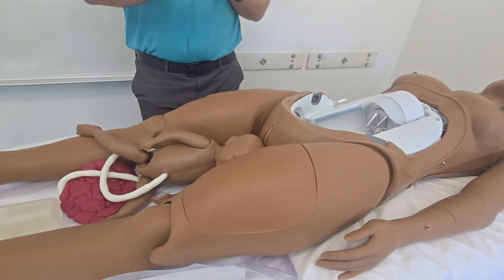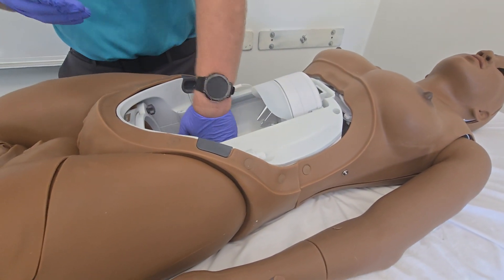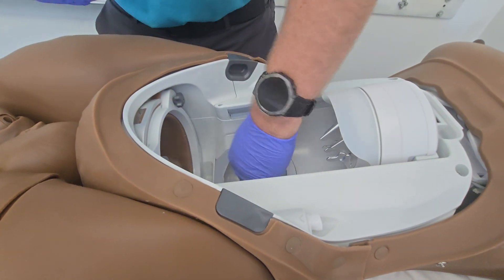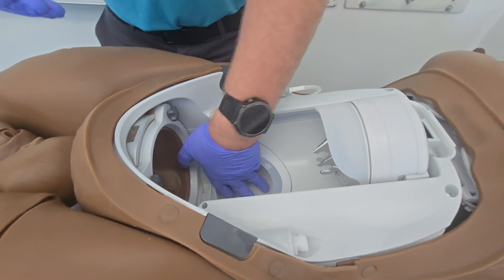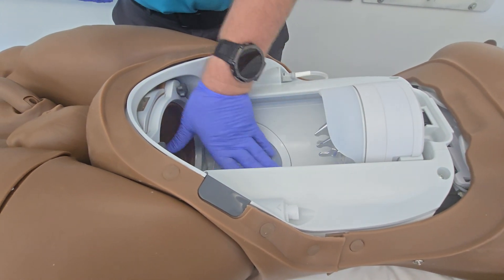We're going to go ahead and start by lubricating the delivery module. You'll notice there's a cavity towards the bottom — this is what we call our placenta pocket. When we're loading the baby in, the placenta is actually going to go into this pocket first, and that's towards the end of the delivery when the placenta is delivered — that's where it's going to be coming out of.